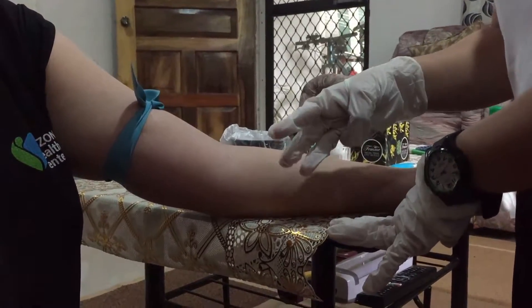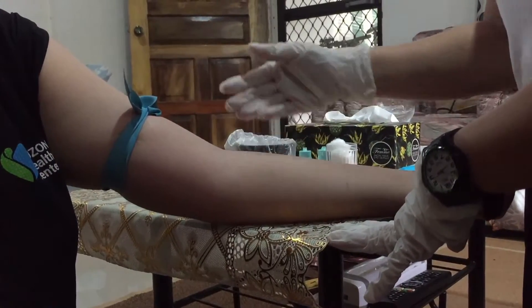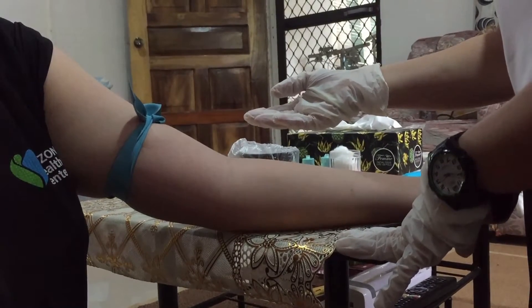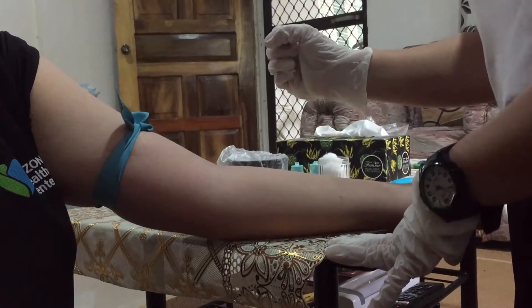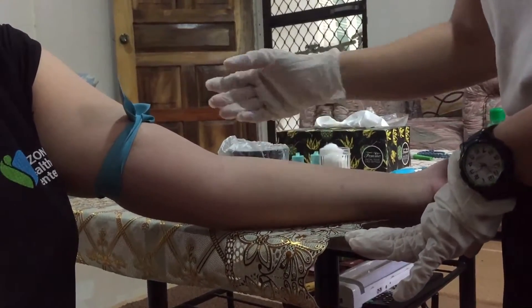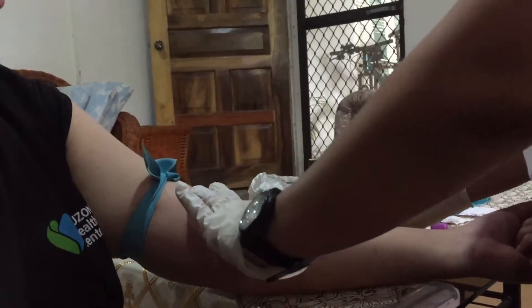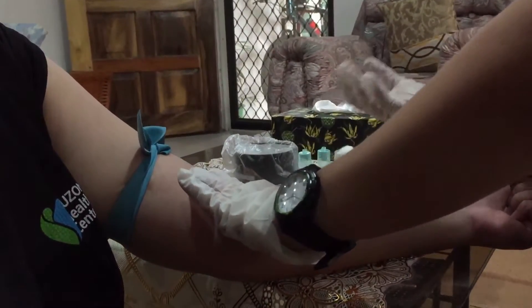We have three veins available here. We have the median, the cephalic, and the basilic. Our first choice will be the median. The next priority will be your cephalic and then your basilic. So I'll have to palpate the vein. Ma'am, kindly make a fist.